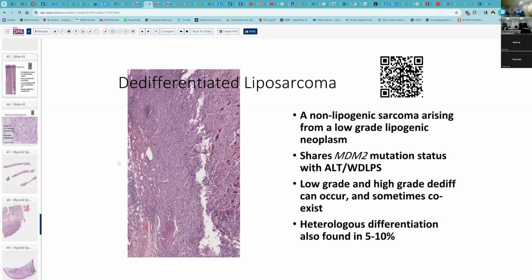And then the atypia of the cells. Thank you very much. Finding atypical cells in the fibrous tissue would help to differentiate lipoblastoma, where you have no atypia, from the well-differentiated liposarcoma, where you should have those occasional atypical cells that are present.